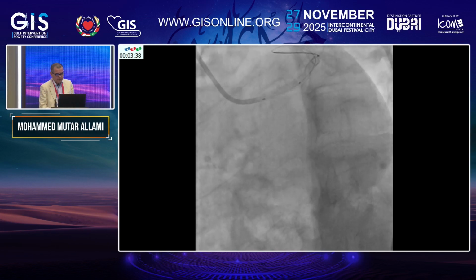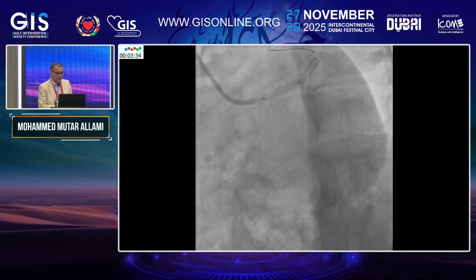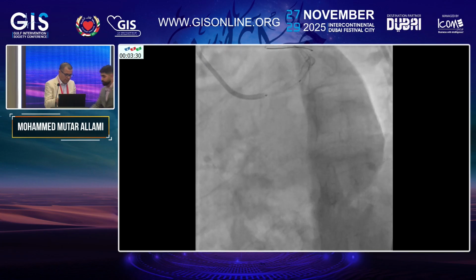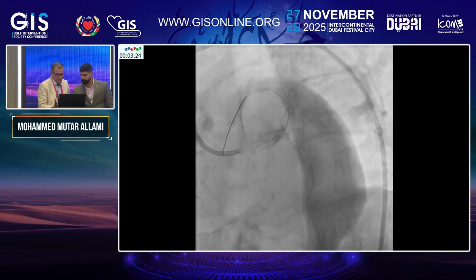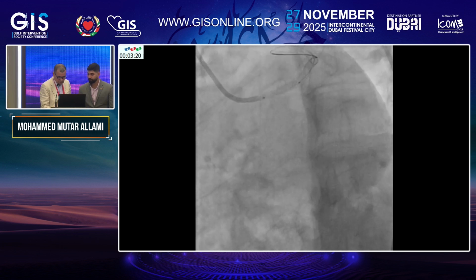So we heard snaring, Hassan. What do you think about snaring? I mean, the main question is the stent is hanging, half of the stent in the aorta, right? So one is leave it, don't do anything. Two is take a microcatheter and rescue the circ because you already wired it.